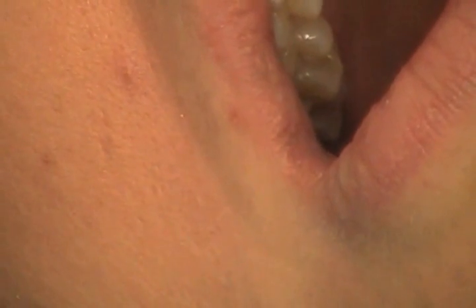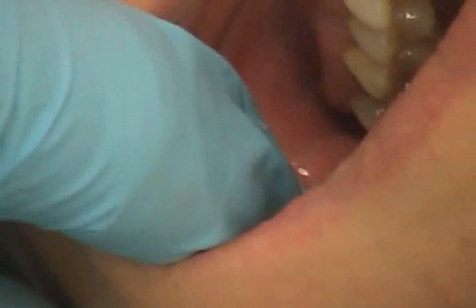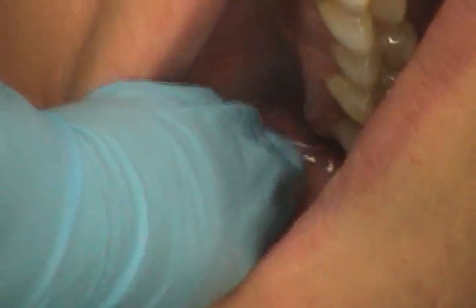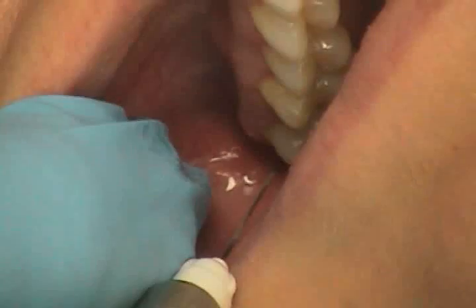The patient position is supine or semi-supine with their mouth partially open and the mandible towards the side of injection. Operator position is on the right side at 8 o'clock facing the patient, or on the left side at 10 o'clock facing the patient. Landmarks are the mucobuccal fold, the maxillary tuberosity, and the zygomatic process of the maxilla. The target area is the PSA nerve, which is posterior, superior, and medial to the posterior border of the maxilla. The syringe position is upward, inward, and backward, maintaining a 45-degree angle.